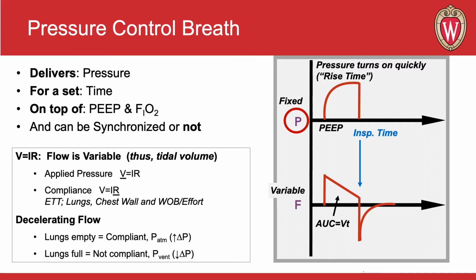Now, like I had you take in deep breaths and pay attention to the airflow over your nose, do that again, and you notice that there is a lot of flow and cold air going over your nose at the start of a breath. And as your lungs fill up with air, there's less and less airflow through your nose. That is shown here on the slide with this decelerating pattern of airflow.